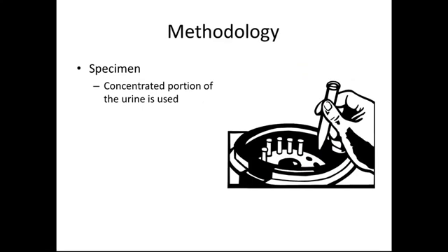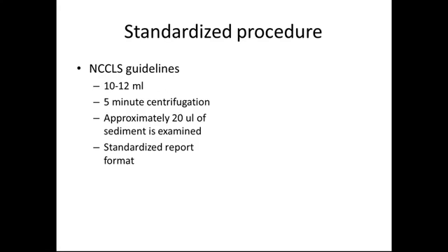So methodology, we are testing the concentrated portion of the urine. It is a standardized procedure, and we use NCCLS guidelines, which include in the exam 10 to 12 milliliters of urine, a 5-minute centrifuge, approximately 20 microliters of sediment is examined, and a standardized report format is used.